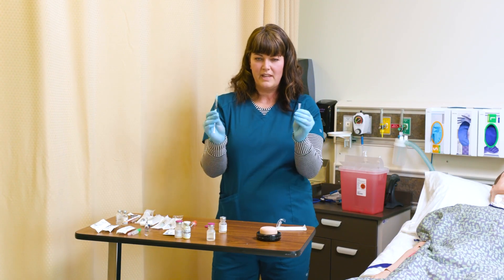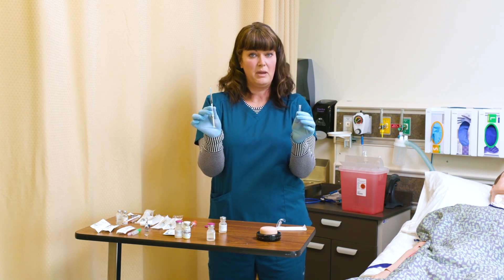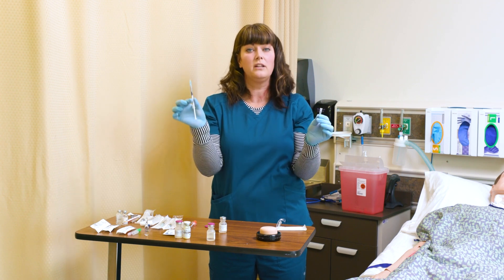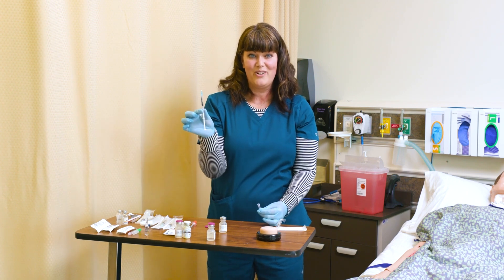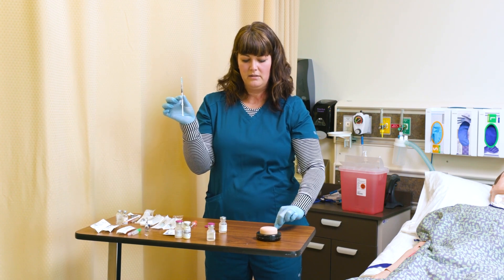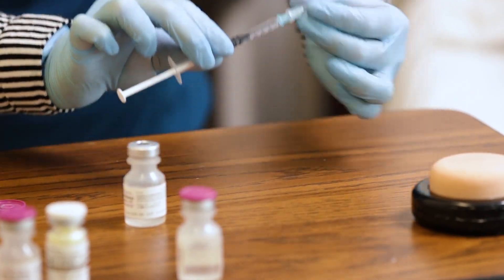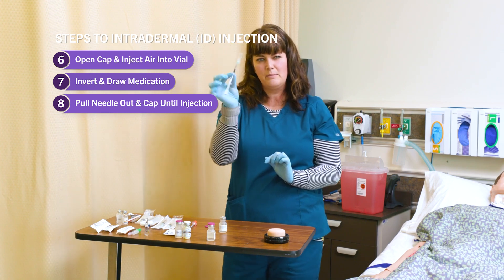This is now considered a clean needle — I have not injected it into my patient. If it were dirty, meaning after injecting the patient, it goes immediately into the sharps container. But I'm not going to walk around with an uncapped needle. To recap it safely, I set my cap down and do a one-handed scoop, scooping the cover back on and popping the lid on. Now I'm safe to carry this around.